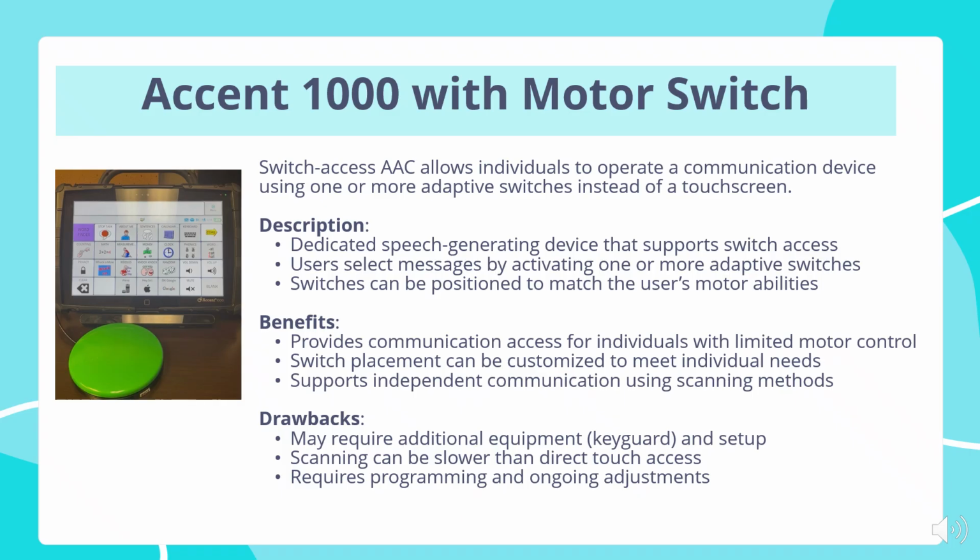However, these systems typically require setup and additional equipment such as a key guard. Because scanning is often used to select messages, communication can be slower than direct touch access, and programming or ongoing adjustments may be needed over time.